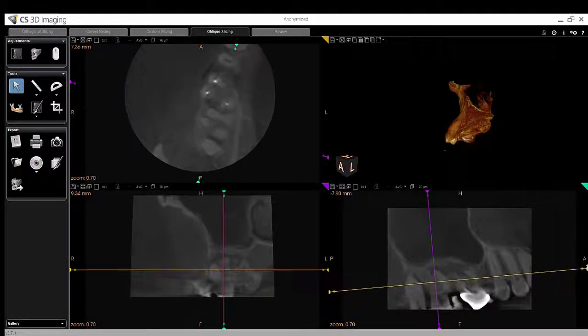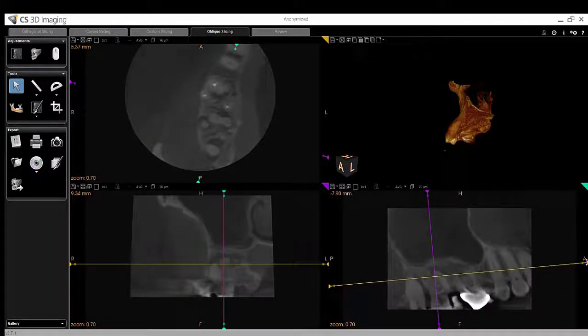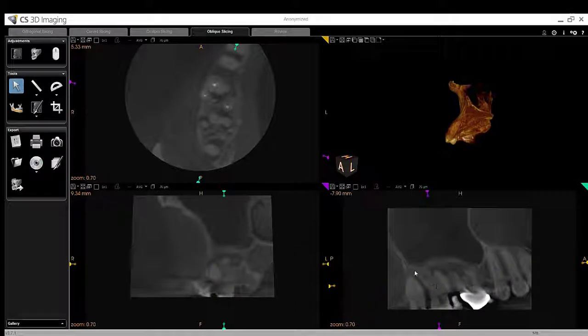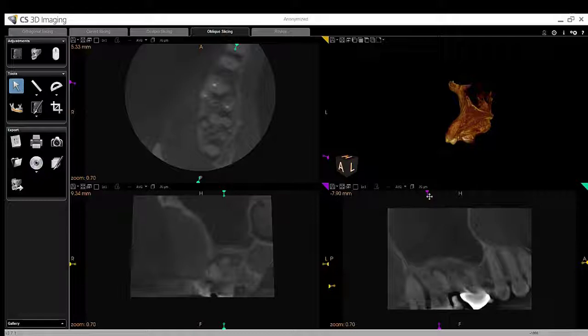I did speak to the general practitioner, and he agreed with extraction of tooth number one and moving forward with non-surgical endodontic therapy on tooth number two.